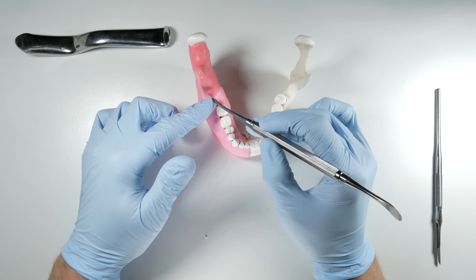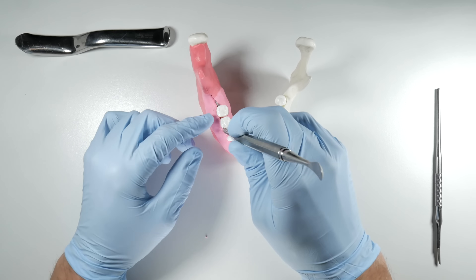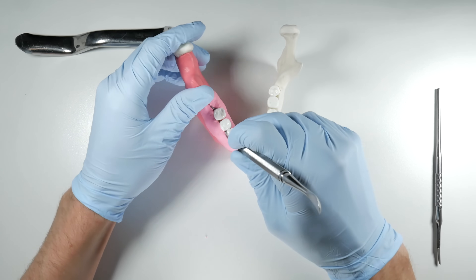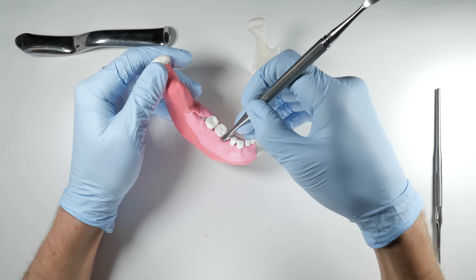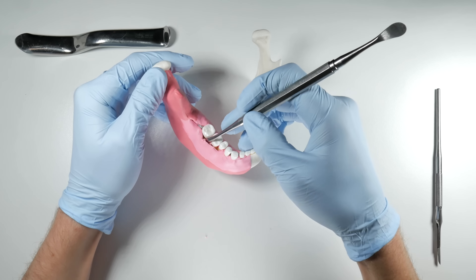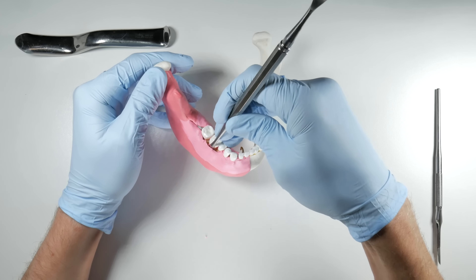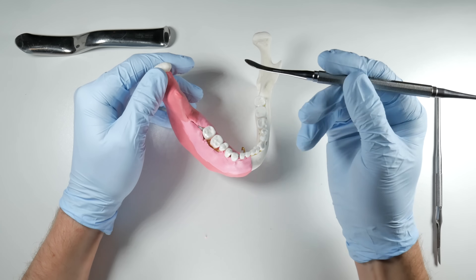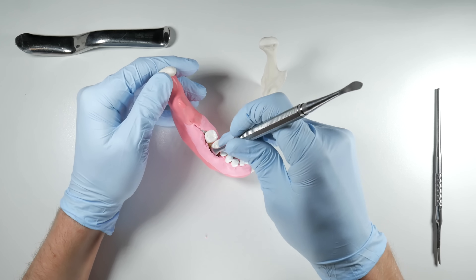Once you've done your incision and carried it all through, use your periosteal to lift the papilla. Start between the first molar and the lower second premolar — push down to the bone, then twist and lift. Trace around the sulcus, twist and lift, pushing that papilla away. Then work with the tip of the periosteal on the bone underneath in a side-to-side motion to lift and free the flap, opening up a gap alongside the teeth where you can get the broader working end of your periosteal in. Push it distally, sliding it along the bone.